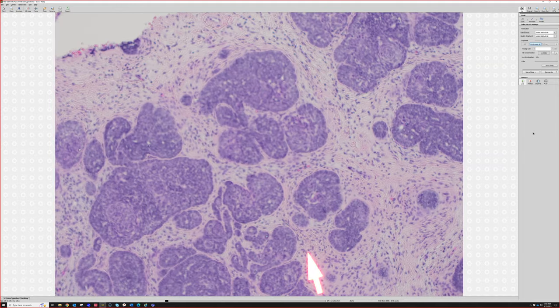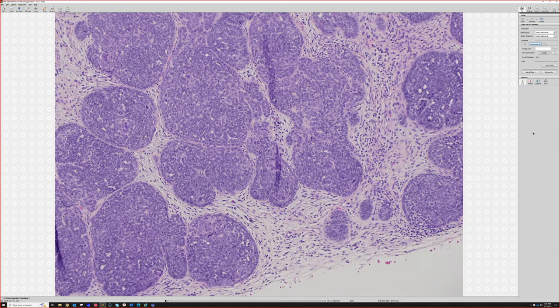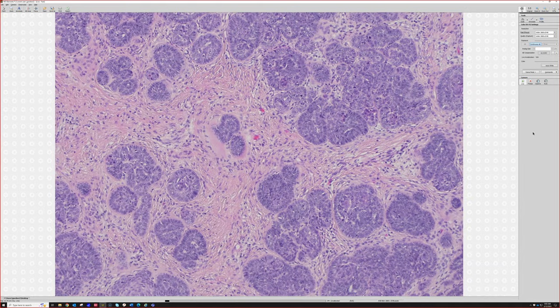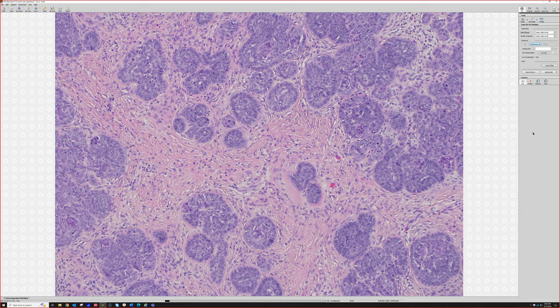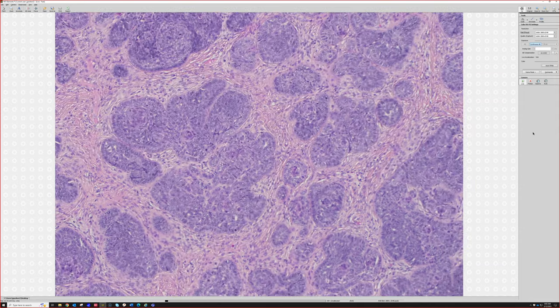Okay, so then the next thing is to look at the stroma. The stroma is wrapped tightly right around the edges, usually with no clefting, or sometimes very focal, rare clefting, but usually no clefting. And here it's a more fibrous-looking stroma. It's just got a look, okay? And it comes right up.